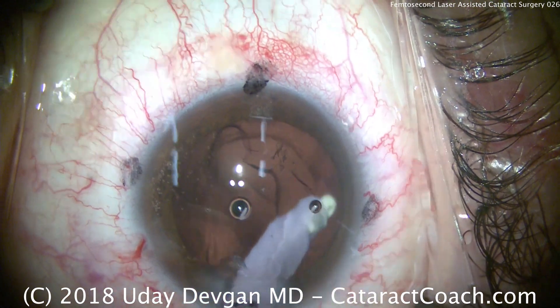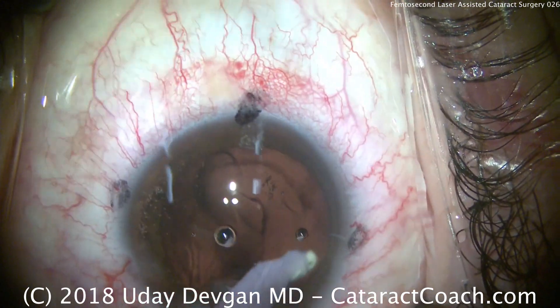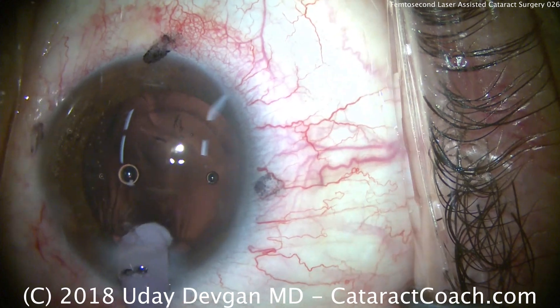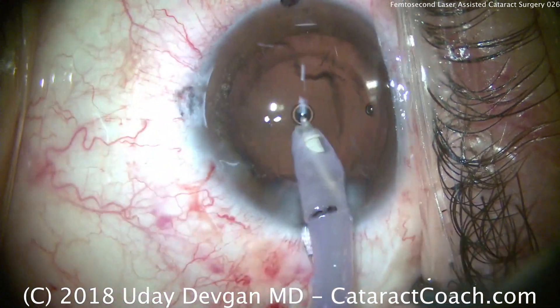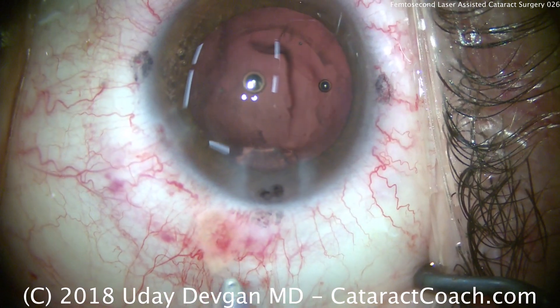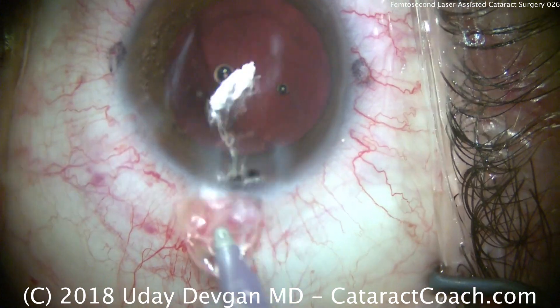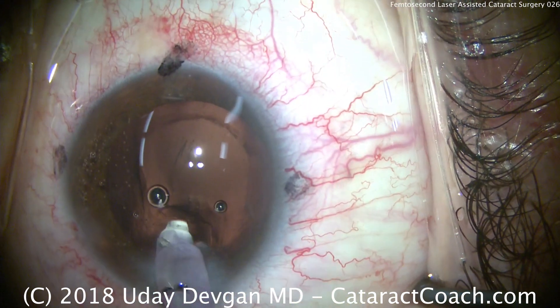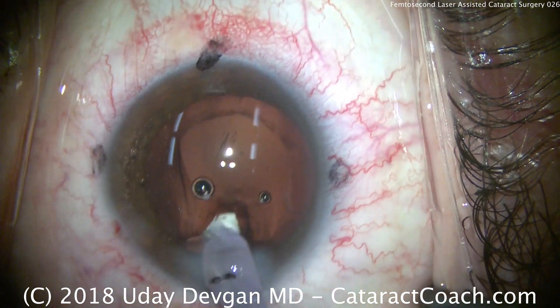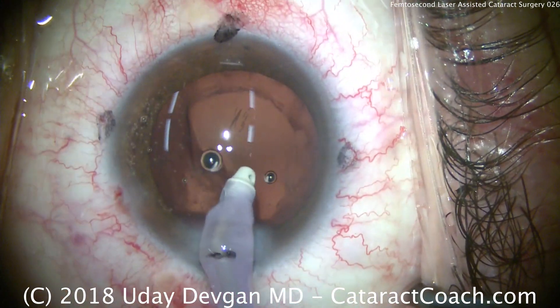Using the femtosecond laser does speed up certain aspects of the procedure — once we go to the OR with the capsulotomy already done and the nucleus already divided, it makes for a very efficient case. The total case time here is approximately five or six minutes. Keep in mind, however, we also have to go to the laser suite to create the capsulotomy and nuclear division, which takes additional time.